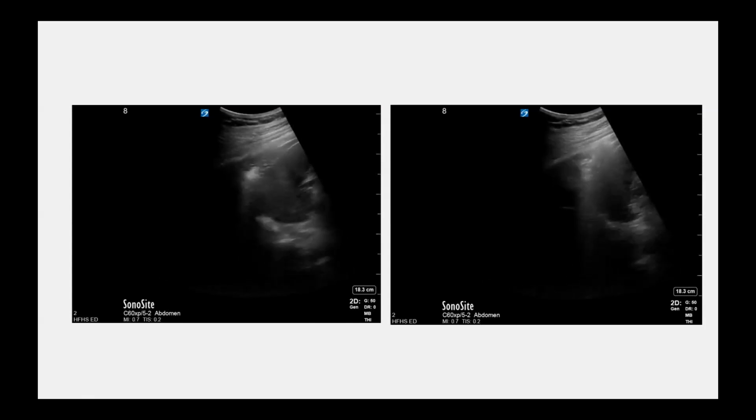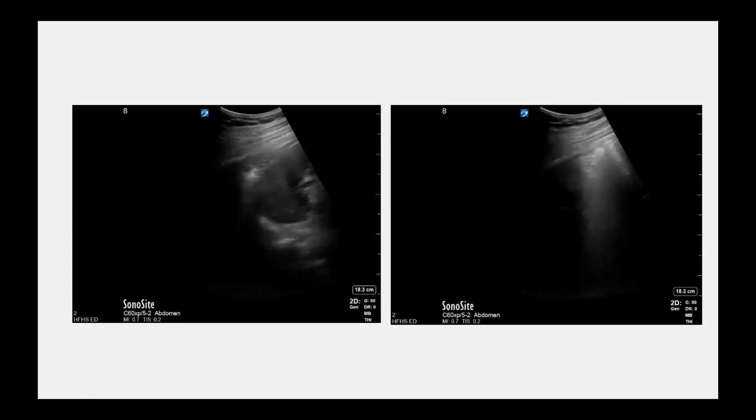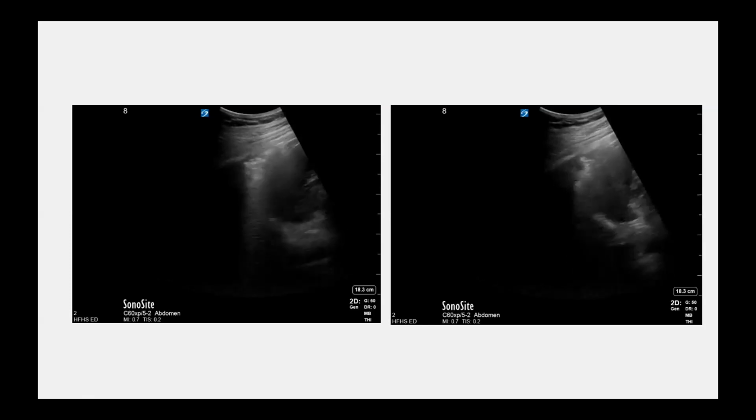So depth adjustment would be indicated if you are doing a QA review. First of all, you increase the depth for overall perspective, but after evaluating and finding pathology, looking at all that, the shred, the irregularity of the visceral surface, can't even make it out, and there's that subpleural effusion or area of anechoic findings as well, you would then decrease the depth to improve your resolution to better evaluate it. Another point is what Dr. Susanski pointed out. You can also change your transducer if you want specific evaluation of that anterior visceral surface, in which case you can select a linear probe with higher frequency to evaluate that area. But in this case, just adjusting your depth will give you enough information to make that diagnosis.